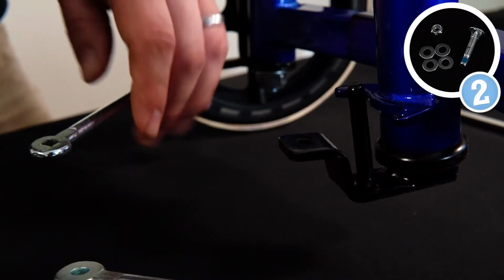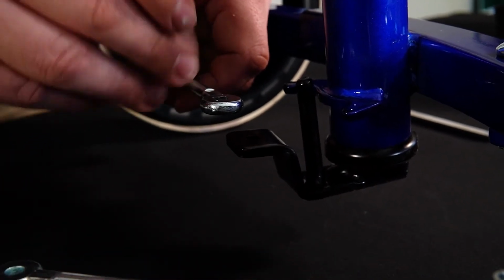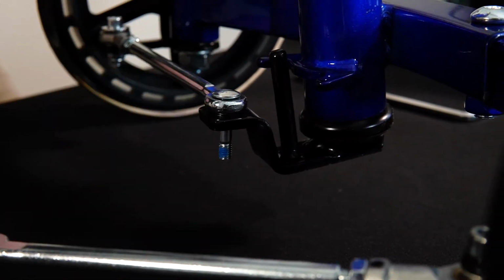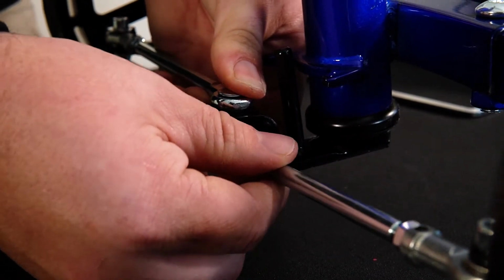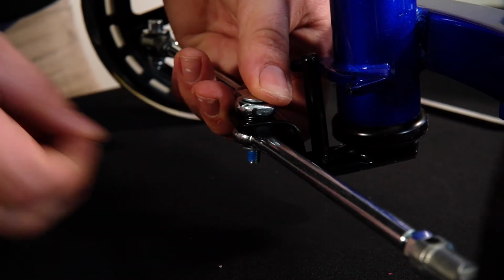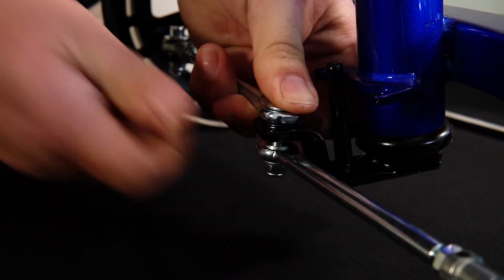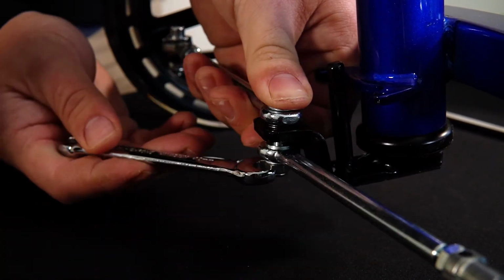All right, so step 2, we're going to go ahead and assemble the tie rods. We're going to take this bolt here, drop it down into this square hole and lock it in. Then we're going to take a washer, drop it down into the black plate. We're going to do another washer, hold it there, grab your other tie rod, pull it up. Then you're going to do 2 washers, and then you're going to do the nut. You can screw that on hand tight just for a second, and then you're going to use your 10mm wrench to tighten it on up.